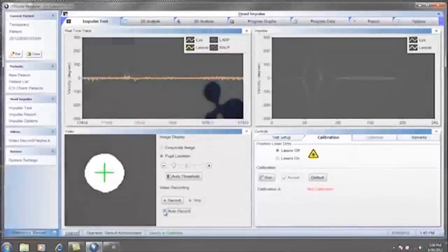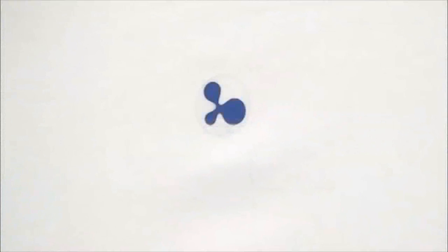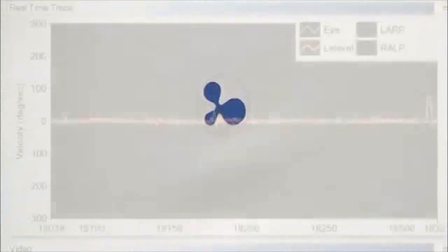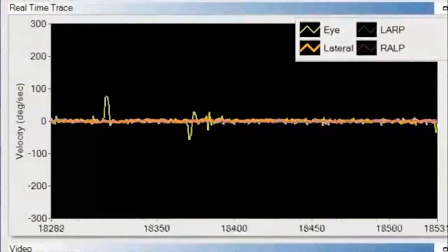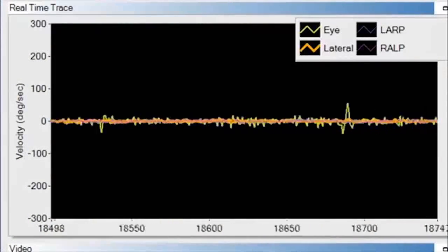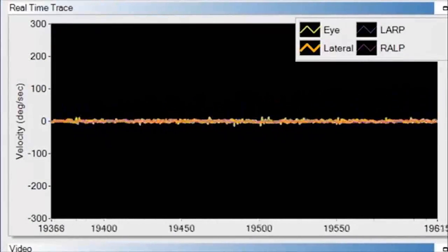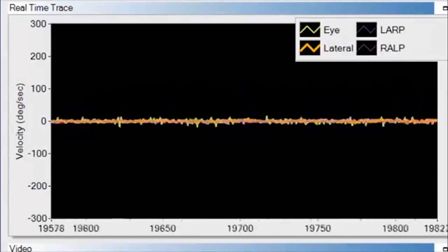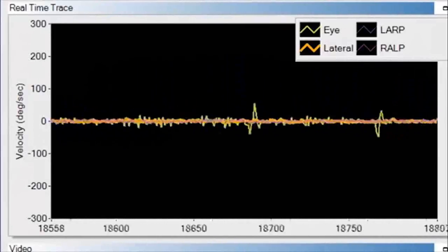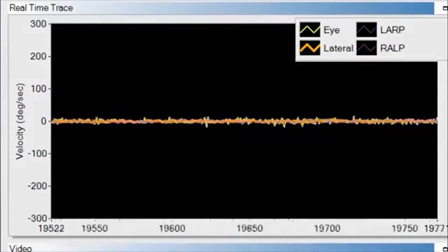Now the patient will stare at the fixation dot. Observe the green eye trace in the real-time trace window, ensuring that it is as flat as possible when the patient is fixating on the fixation dot.